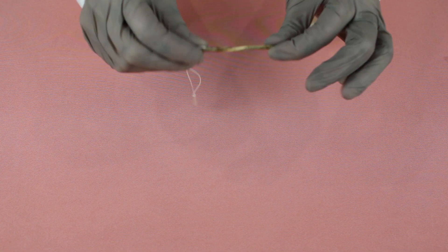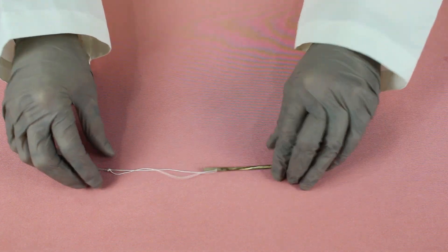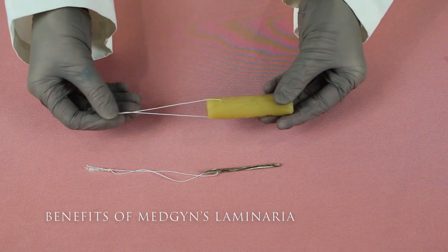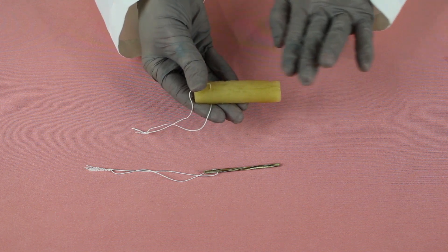With the 5mm, after leaving the stick in a cup of water overnight, it looks like this. As you can see, the diameter has grown exponentially, but the Laminaria has kept its shape.